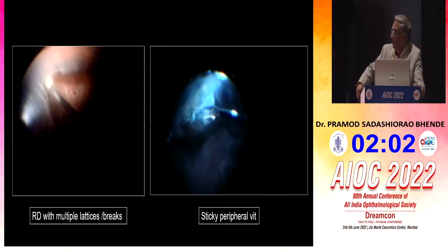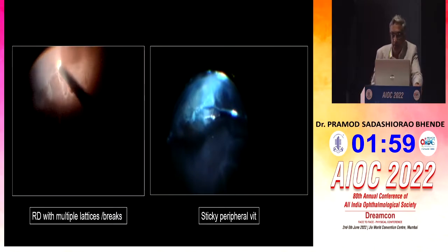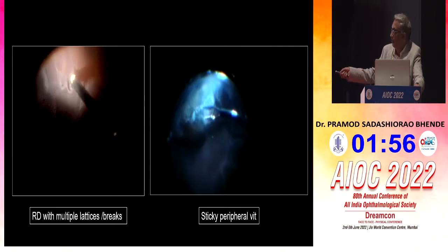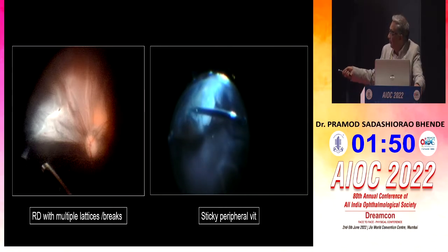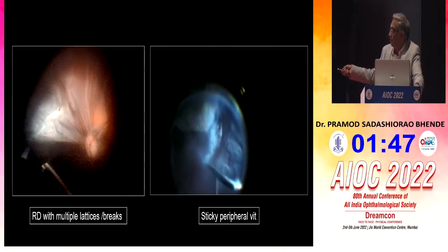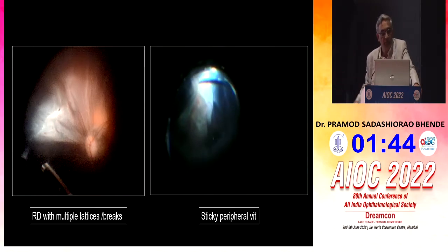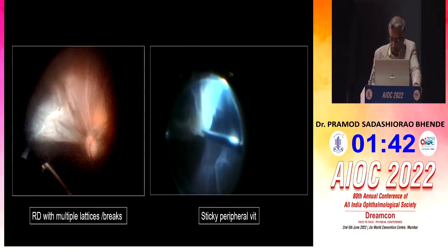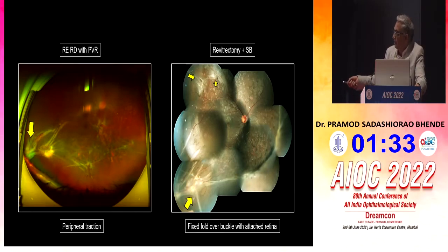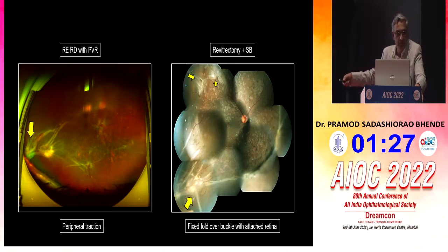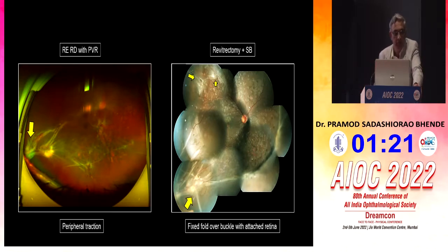If you leave this vitreous behind, it will contract and subsequently the patient will come back with recurrence, eventually requiring a relaxing retinotomy along this edge. In this case, the vitreous is extremely sticky — try to peel it off as much as possible, but some amount of residual vitreous is always there. These are typical cases where you need to add an external buckle to support. In another recurrence case, rather than cutting the retina, what I did is support it with a segmental buckle and the retina settled down without doing a relaxing retinotomy.